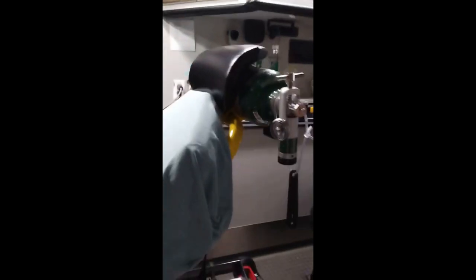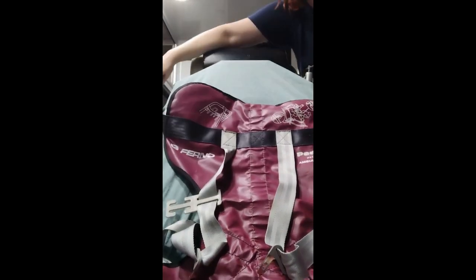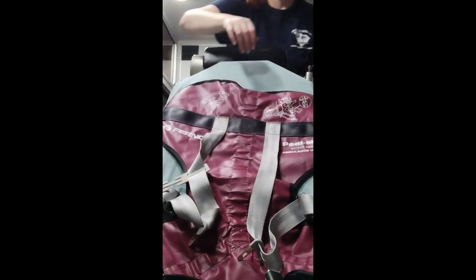First thing you want to do is raise the head of the stretcher up — it doesn't have to be straight up, but at a good angle. Then you want to take these big black straps on either side and they're going to go around the head of the stretcher and buckle behind it. This is what secures this part of the PD mate to your stretcher.